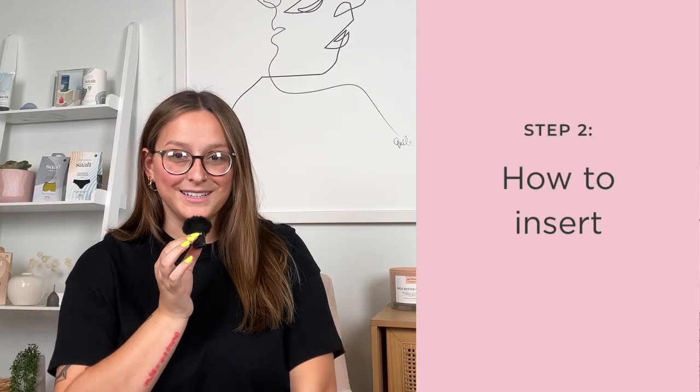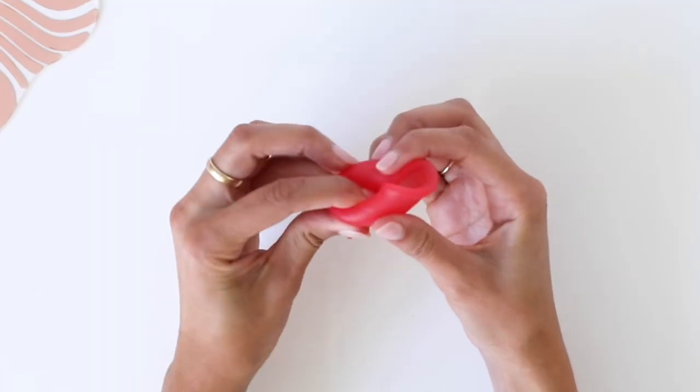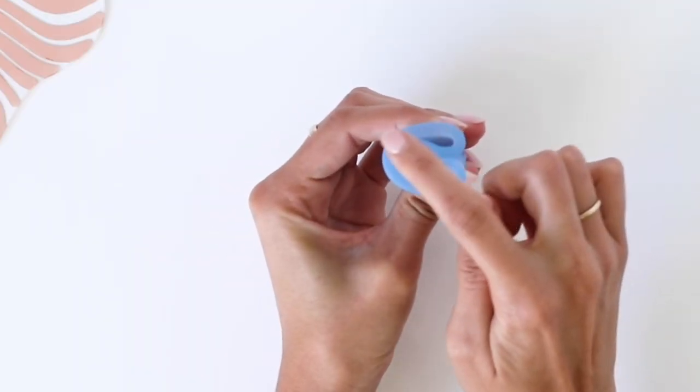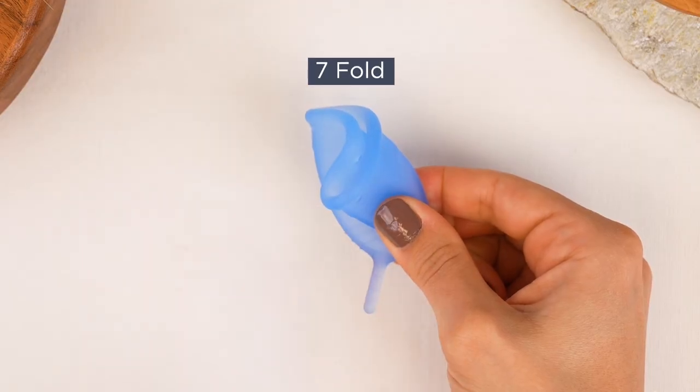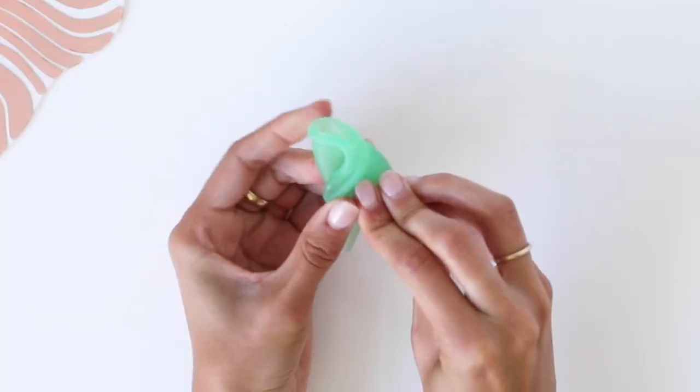Step 2, how to insert your menstrual cup. First, you're going to want to fold your cup. There are a few folds that you can choose from. The first is the punch down fold. You're going to push one side of the rim down into the center. The next fold is the C fold. You're going to pinch the cup flat and fold it into a C shape. Lastly, we have the 7 fold. Similarly to the C fold, you're going to pinch the cup flat and fold it into a 7.